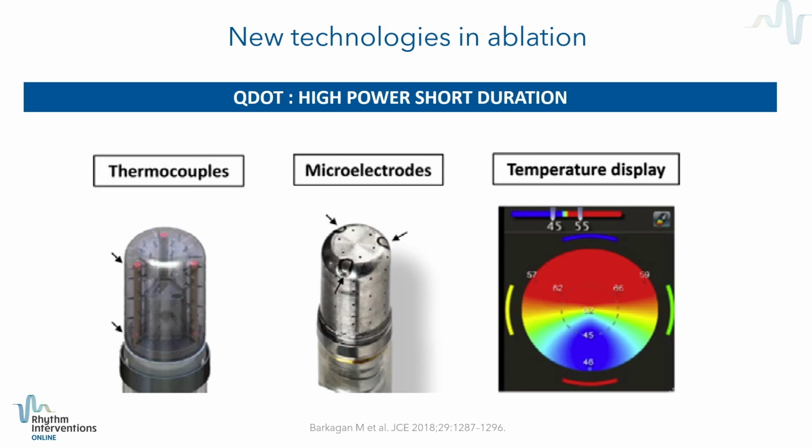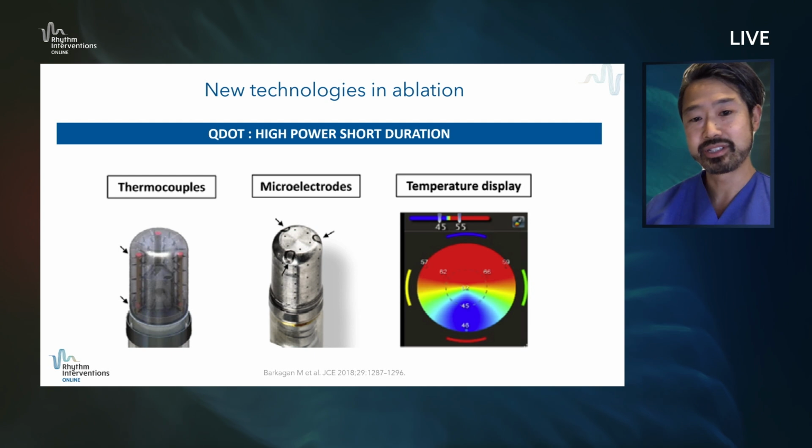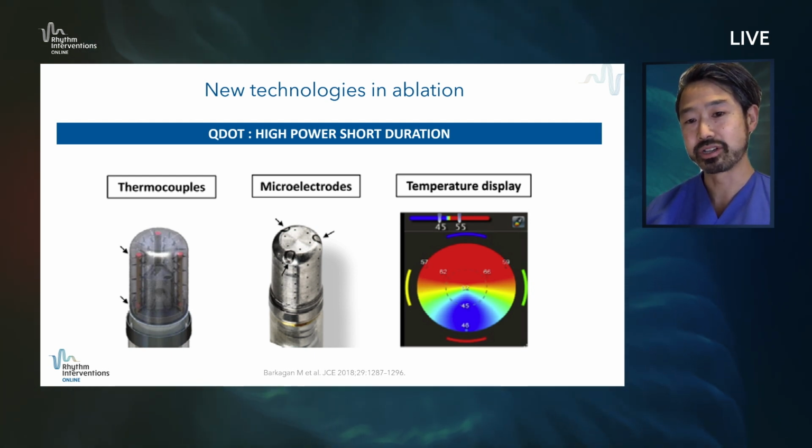And this concept is challenging and very interesting because on the other hand, we may also think of having potentially lower side effect damages, such as maybe burning into the esophagus. And this is one of the new kids on the block, which is the so-called Q-dot catheter.